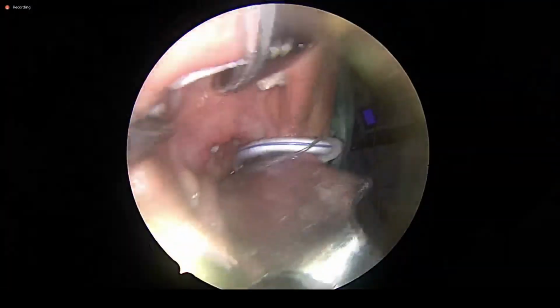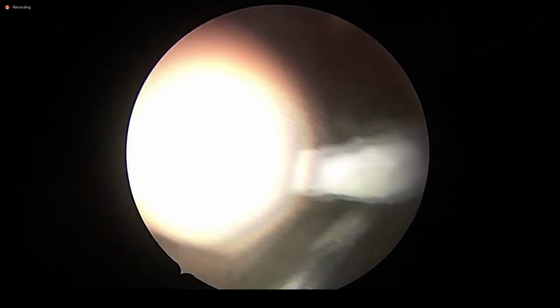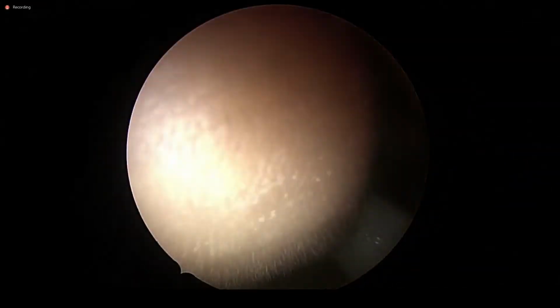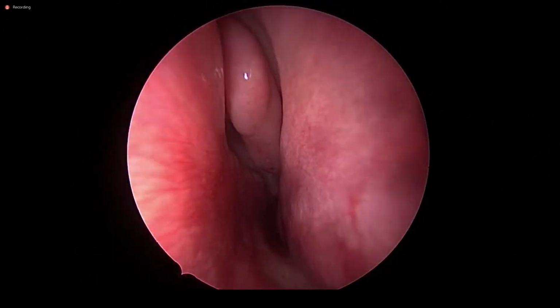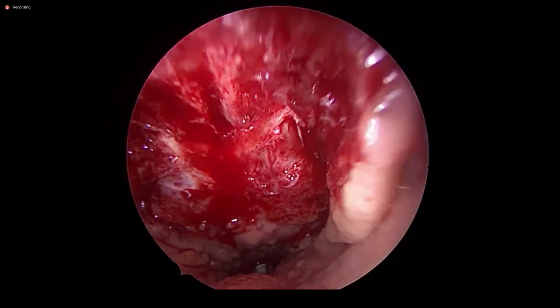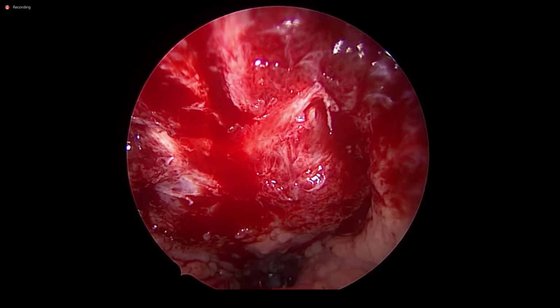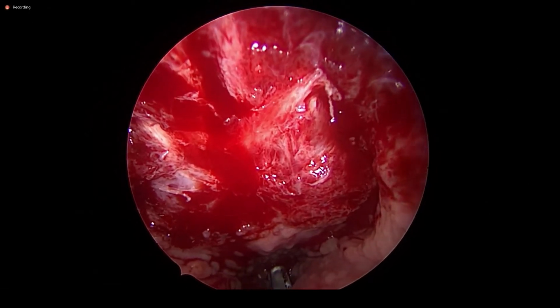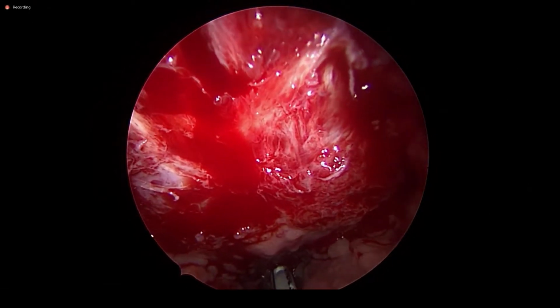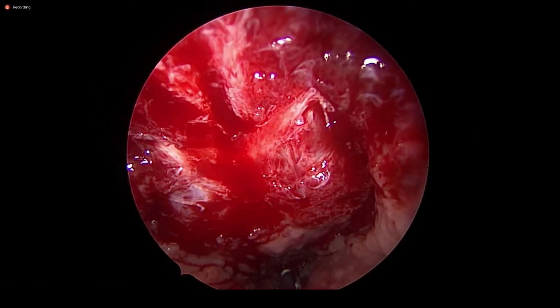At present, no questions, sir. Sir, one question, sir. We see there is active bleeding near the periosteum. So how do you coagulate this bleeding? Do you use any coagulator or not? Near the periosteum, coagulator you can use over the periosteum. I will show you.